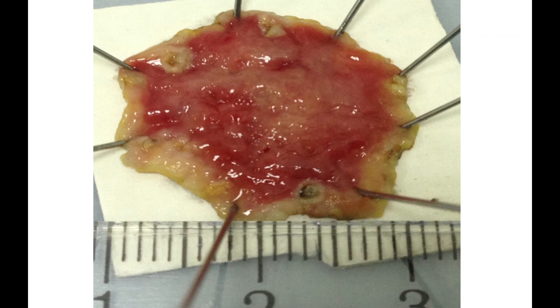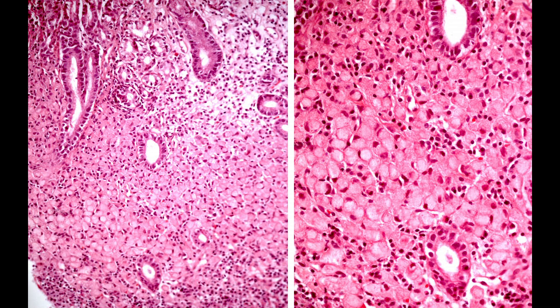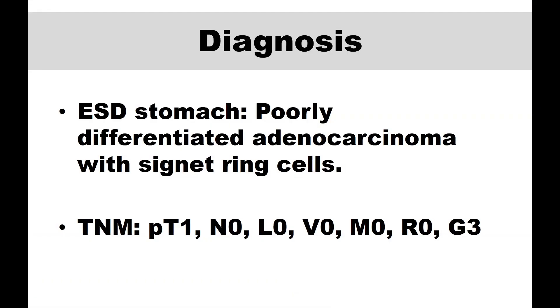This is the ESD specimen. You see an uneven surface at microscopy, and here you can see that the glands and pits are displaced by uniform-looking small round cells with an eosinophilic content. At higher magnification, those cells look very uniformly and are the classic form of signet ring cells. The diagnosis is ESD from the stomach with a poorly differentiated adenocarcinoma with signet ring cells, PT1N0L0V0M0R0 G3.